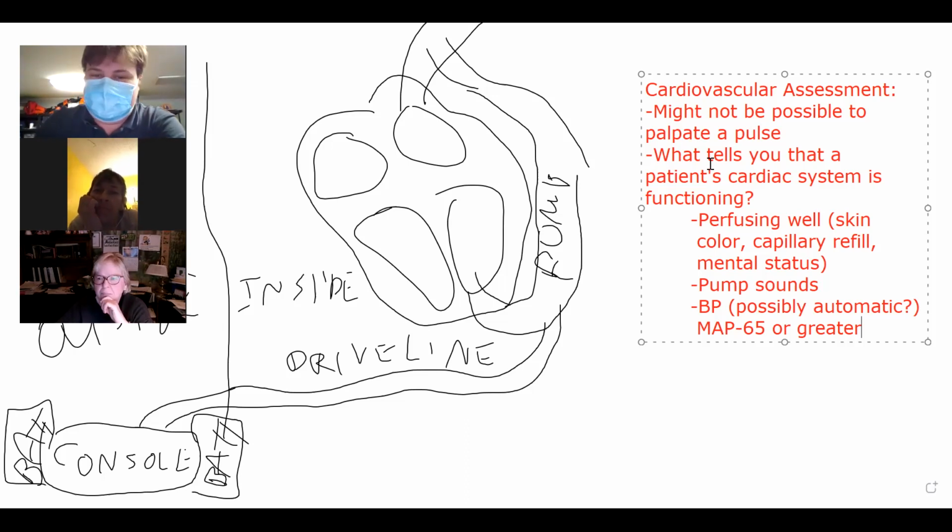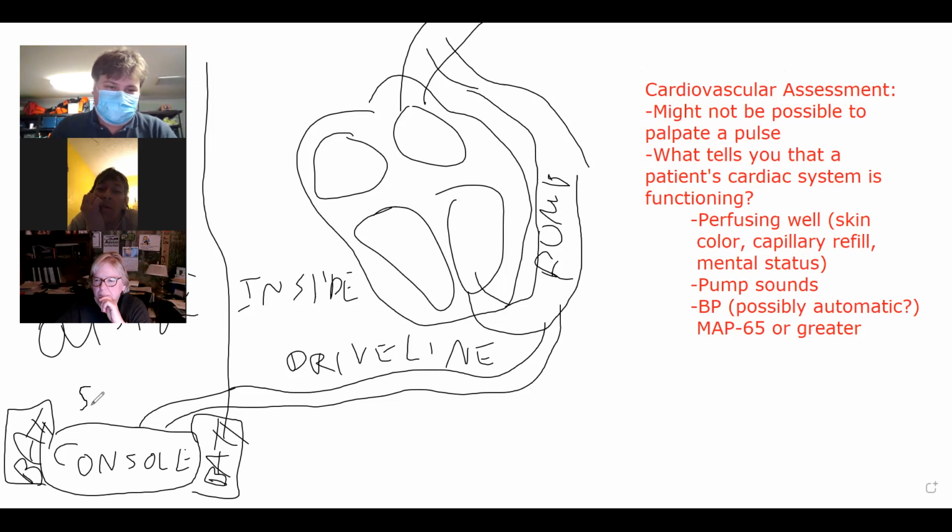The biggest piece of information that I was told by people who are smarter in this field than I am is that regardless of the alarm, the first thing that you need to do when you arrive on scene and hear this pump screaming, other than assess your patient and make sure they're alive, is to hit the silence button on the console. Yes, that's right. They put a really big silence button on the console, and you need to hit it so you can hear yourself think.